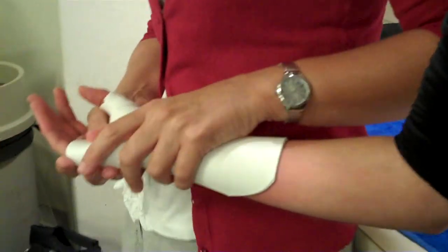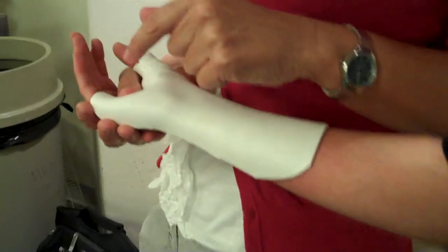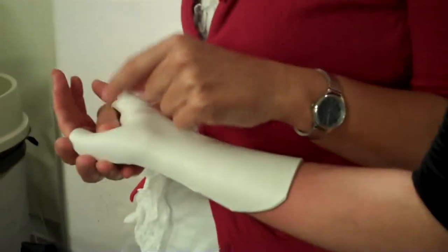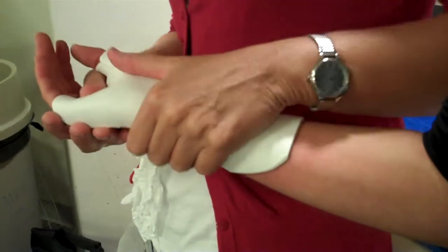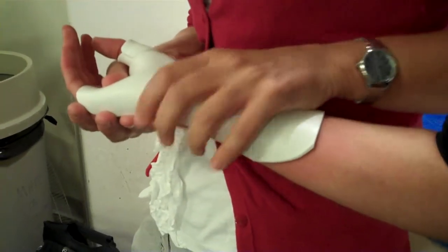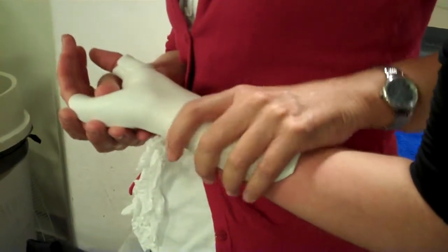Okay? When do you start cutting it and rolling it? It kind of depends. I don't like to let mine totally harden up before I start cutting it, because again, it gets hard. You have more sharp edges. But at this point, I still feel like if I take it off of her, I'm not going to have the form that I want. So sometimes that's when you use your fingernail and you make a little mark here.